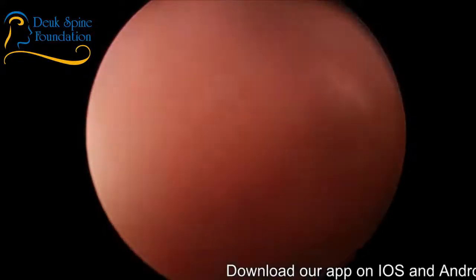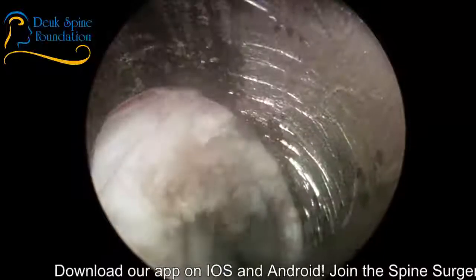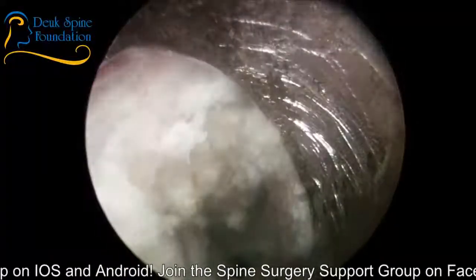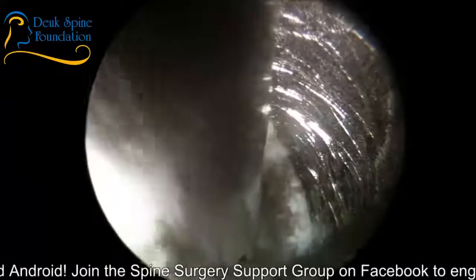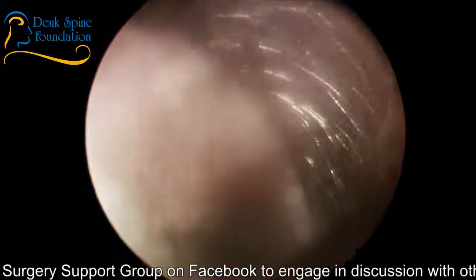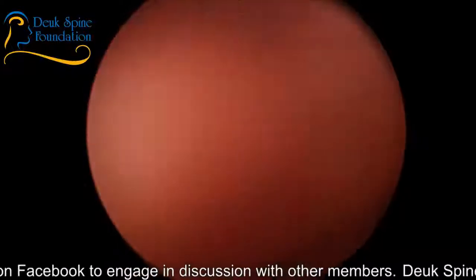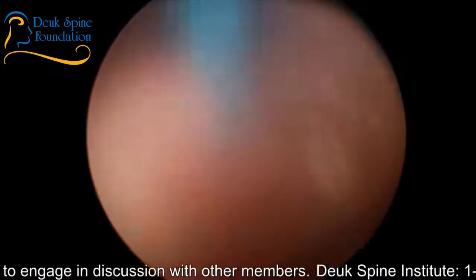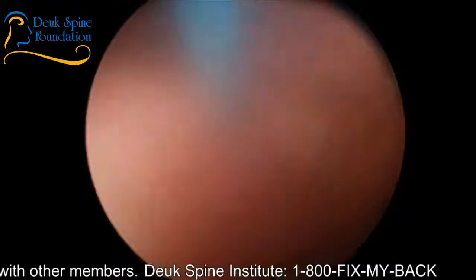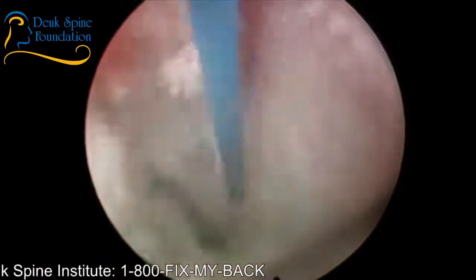Stand by. I'm reaching up in there and trying to pull out any more herniation I can get my grabber around. That's pretty good. Give me that laser. What's bleeding is, we've decompressed the nerve root, and those are just epidural veins that are starting to bleed because the root is now well decompressed. I feel pretty good about it. I'm going to wrap this up in the next minute and we'll get the next herniation done. I think we've done everything I can do here.